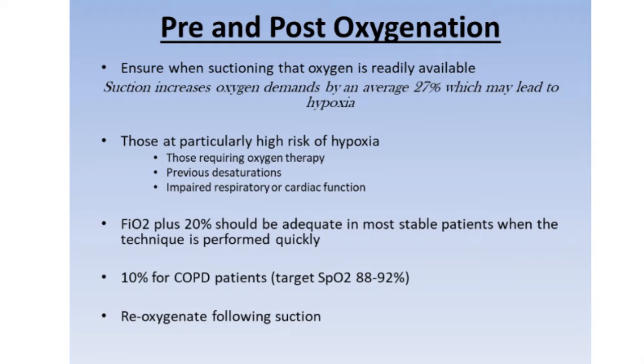FiO2 plus 20% should be adequate in most stable patients when the technique is performed quickly, and 10% above patients' baseline for COPD patients to keep their sats within 88 to 92. Reoxygenate following suction.